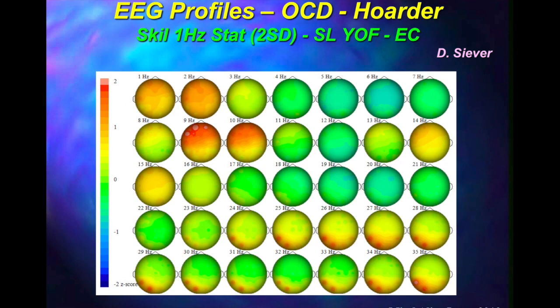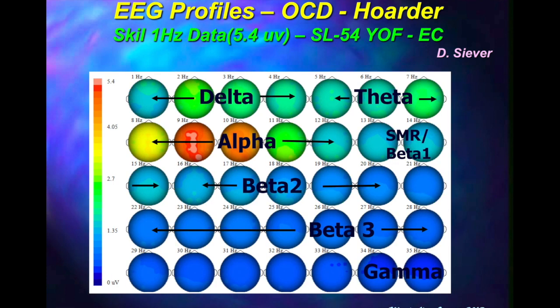On a database, I should just back you up a little bit here. Take a look at this again. This is on a microvolt scale. So this is Fourier analysis, just breaking everything down into frequency components. And we're seeing that the peak is down the center of that cingulate, and it shouldn't be there. It should be in the right parietal, which is further back on the right-hand side.